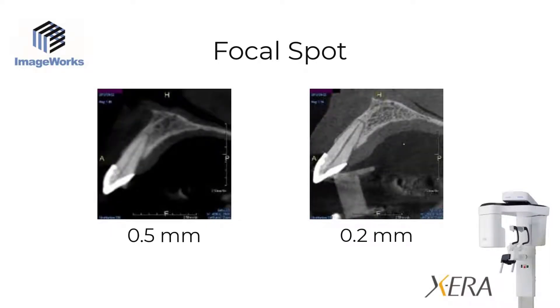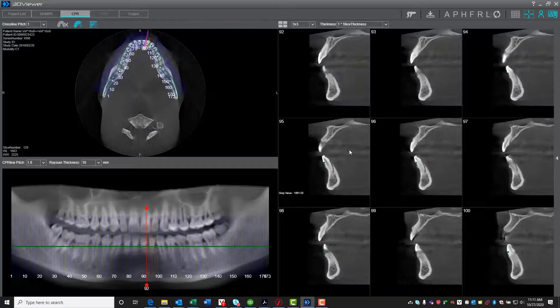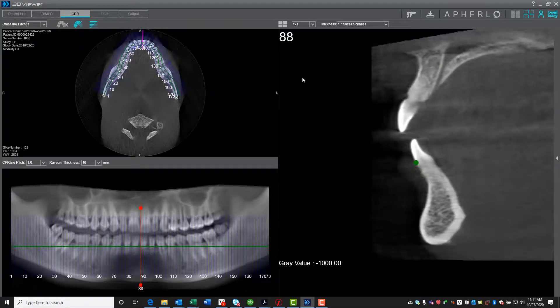Smaller focal spots relate to higher edge sharpness of the object being scanned. The Xera offers multiple fields of view going all the way up to 16 centimeters wide, meaning a scan could be done that captures both TMJ condyles in a single scan. The 3D software is incredibly intuitive and comes with full implant planning capabilities, putting a wealth of information at your fingertips.